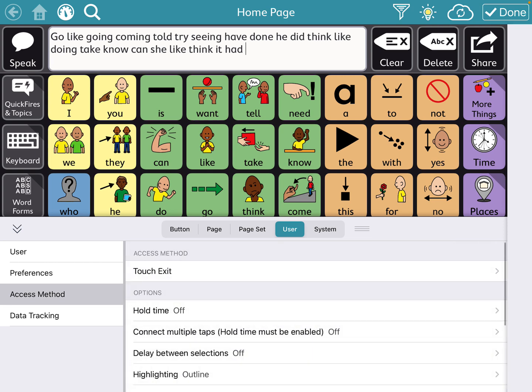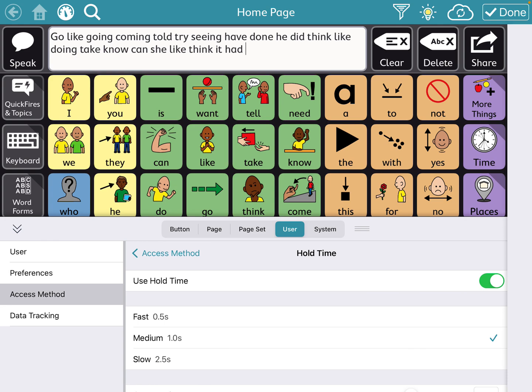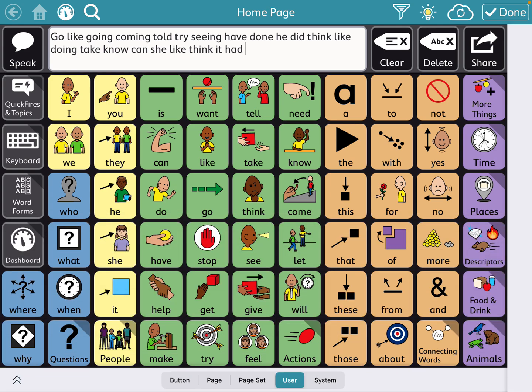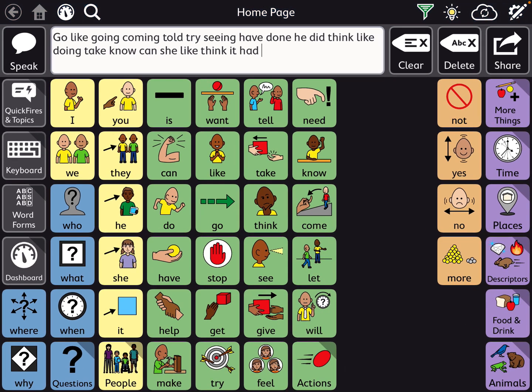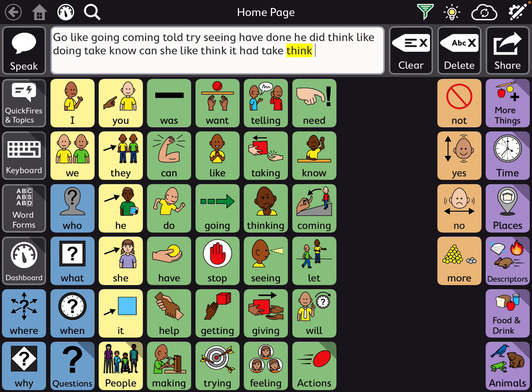So the one I showed you was fast. For medium, it's just a little bit longer that you have to stay on the button. And it will highlight a darker one when it's ready. So it's a one second. So it might be too slow for some kids and great for the other kids. So now, see it will still do it even on these buttons.